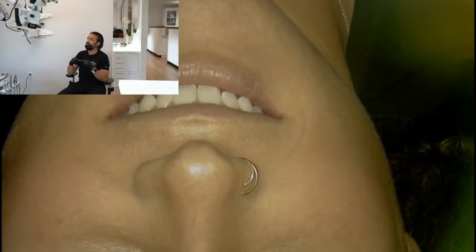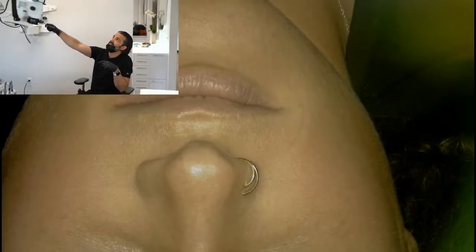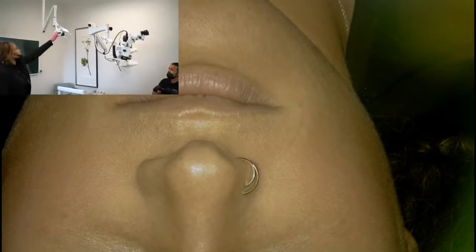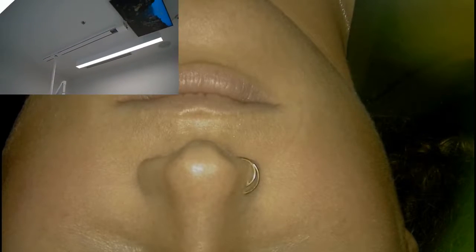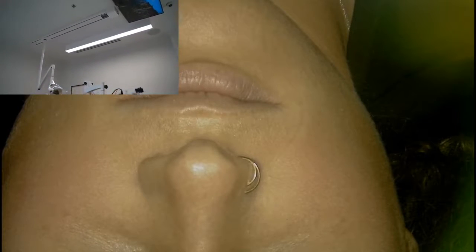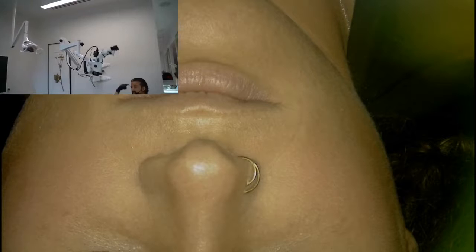Ceiling is a great place to come down, like where this overhead light is. I've done a track system on it, and that's been fine. There's a little drifting when that happens, but then you really have to reinforce your ceiling well beyond what code requires. And it has nothing to do with a microscope falling off the ceiling. It has everything to do with vibration. And then you have to think about what's upstairs.